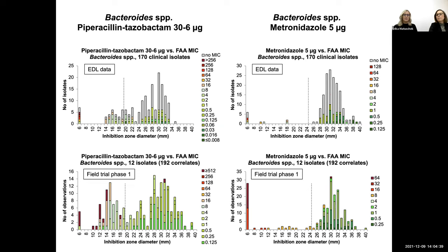And the other Clostridium perfringens strain is just not suitable for checking anaerobicity. So you're sort of between a rock and a hard place. And I think it's the other way around as well, because we have looked into the strain which is recommended to test anaerobicity to be used as a regular QC strain. And it doesn't work, because it usually gets colonies within the zones and you don't get reproducible results. So that has been considered, but it didn't work out well. So we had to choose two different Clostridium strains for this.